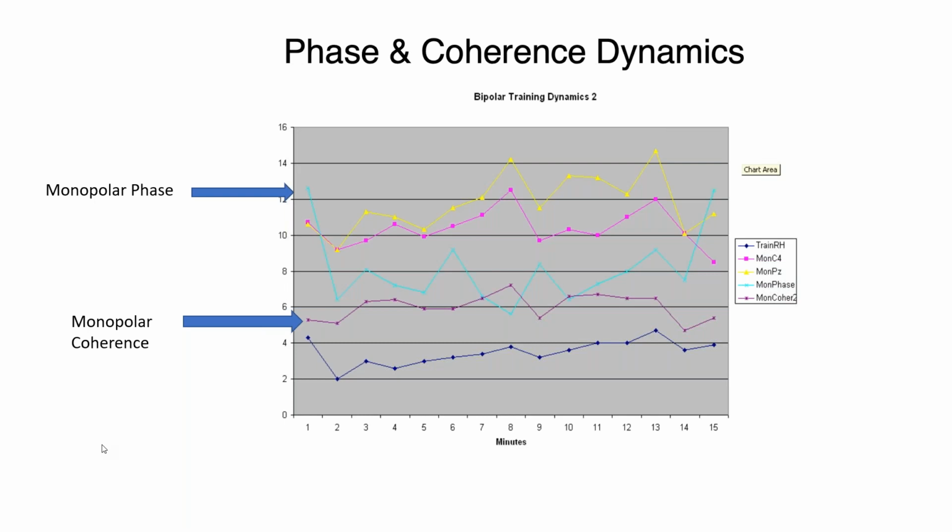Well, because we had 3 amplifiers, it was a mess, Martin. The ears on all, and we did this with several subjects, so it wasn't just one subject. We had so many ear clips on everybody's ears that they looked like a pincushion. I can imagine, yeah. And we had to make sure we didn't get any bridging between all the ear clips. It was a trick getting all that. Thank God everybody had lots of big ears in this group.